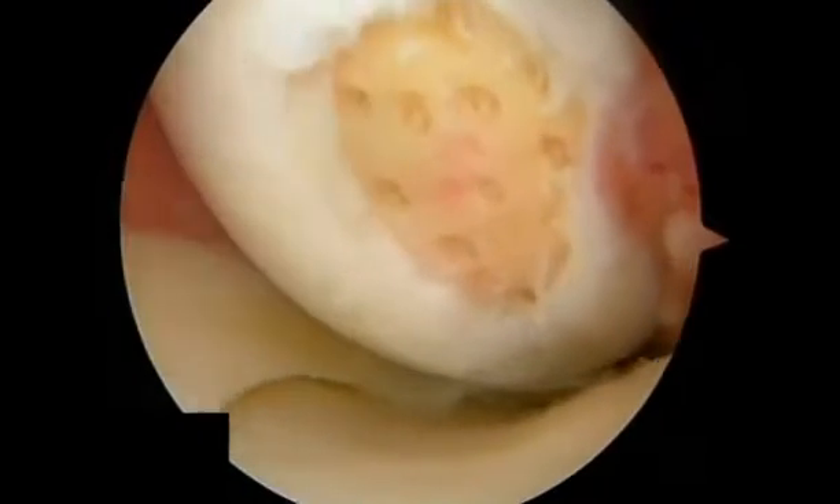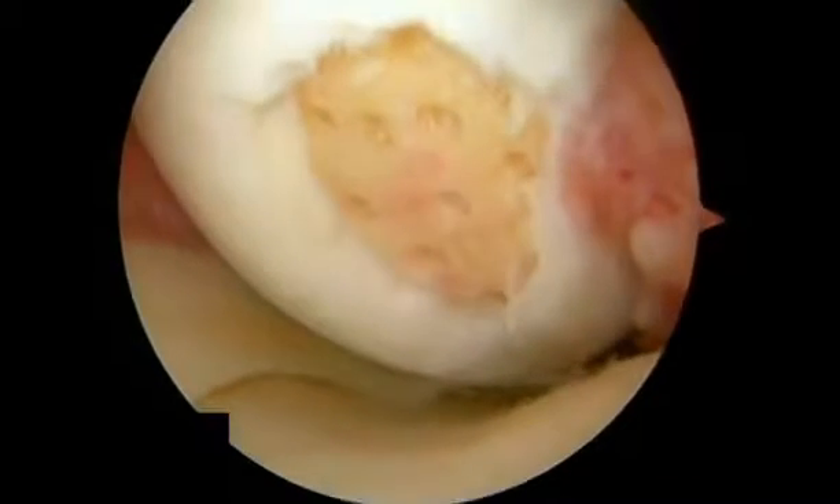Bone and cartilage debris generated during the procedure should be removed from the joint to prevent irritation postoperatively and to ensure the free flow of marrow and blood elements from the perforations.